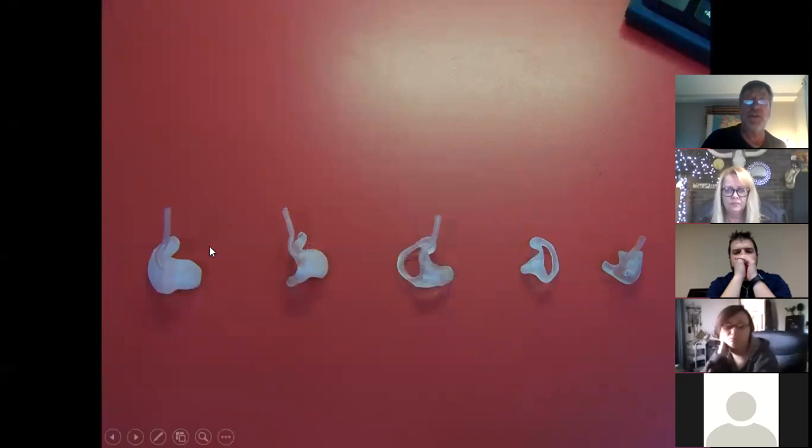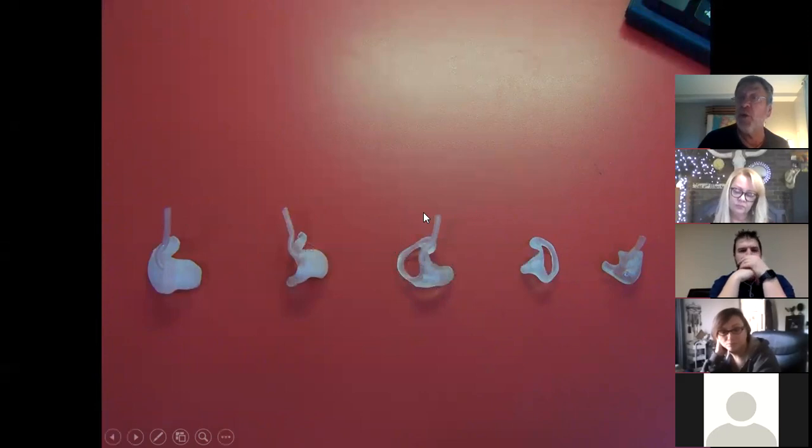On the left, there's your silicone full shell for a whopper of a hearing loss. Here would be that lucite skeleton mold that I just showed you earlier for a hearing loss that's almost a whopper. And also some RIC hearing aids, as you may have seen, have custom ear molds made as well. Have you done that, or have you seen that in clinic at all?